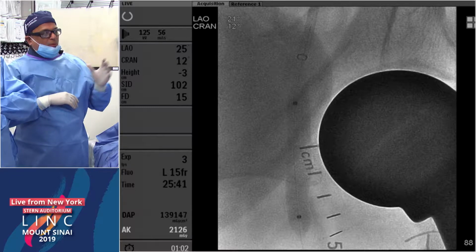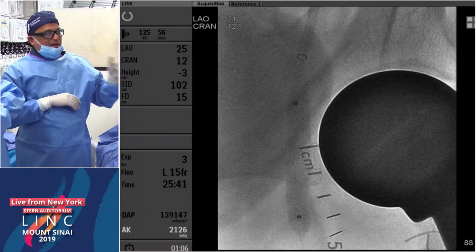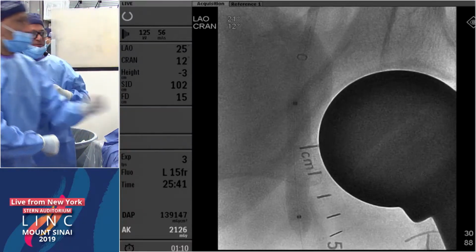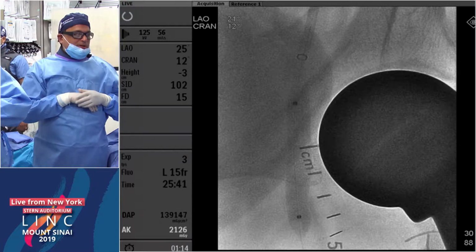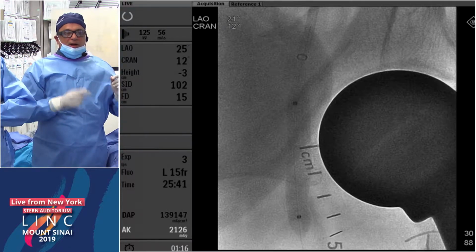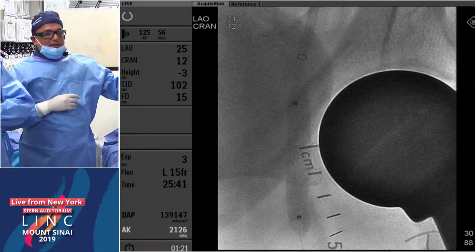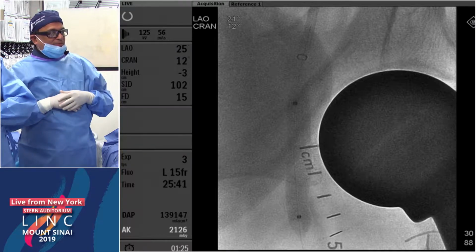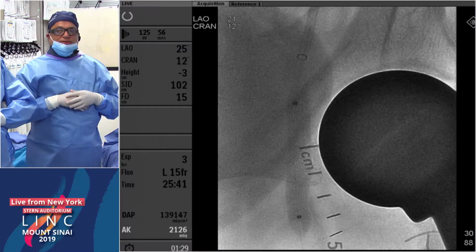So I guess for me the worry is, without an 8.0 Supera, I would find it difficult to put any bare metal stent. I know that we've seen images of access through nitinol stents and so on and so forth. But here, we just showed a case on the opposite side, I know it's only a month and a half or 2.5 months old, whatever it was, where we were able to get access. I think that we preserve the access side and hopefully we get her out of rest pain. So this is kind of the reason why we presented it.